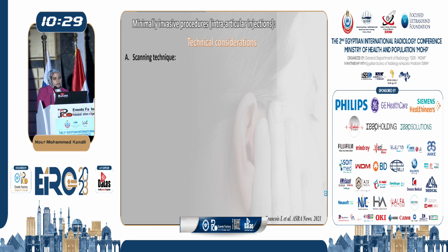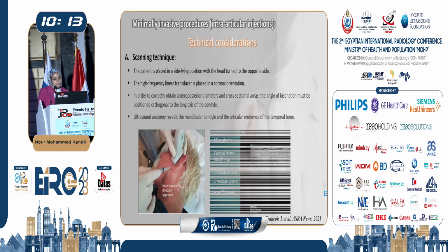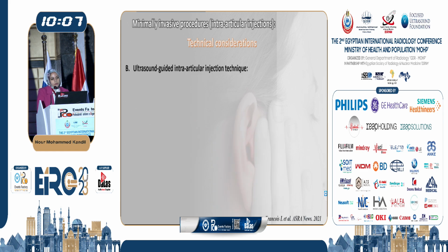Regarding technical considerations, the patient is placed in a side-lying position with the head turned to the opposite side. The high-frequency linear transducer is placed in a coronal orientation. In order to obtain diameters, the angle of insonation must be positioned orthogonal to the long axis of the condyle. Ultrasound anatomy reveals the mandibular condyle and the articular eminence of the temporal bone.